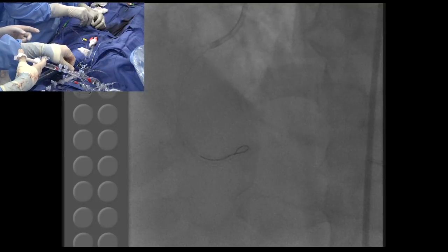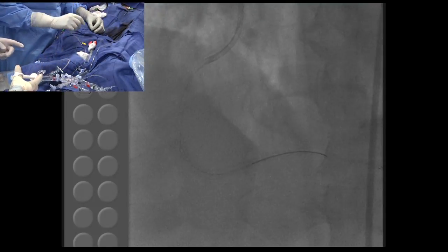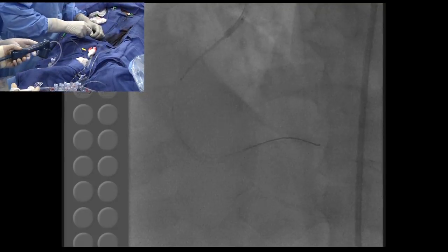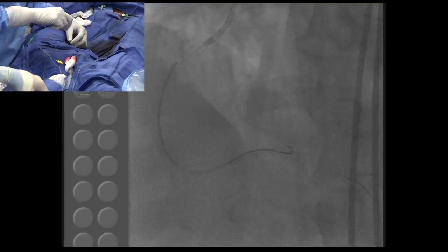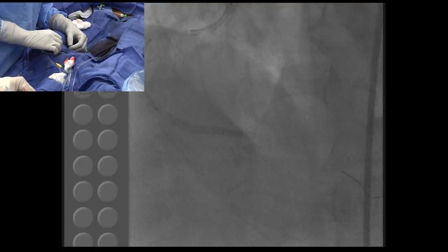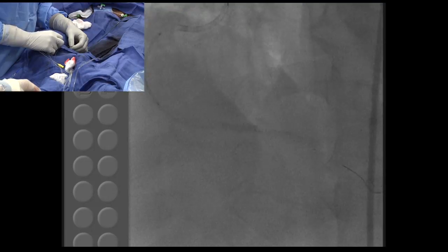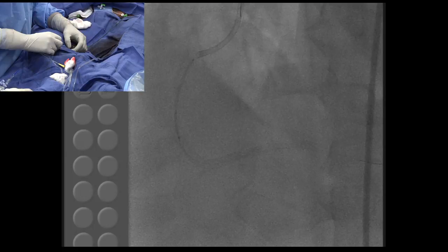Yes. Glad that you were able to add to your collection of contributions to interventional cardiology. I think this is extremely beneficial and hopefully cuts down some of the needless steps in a retrograde CTO. Take a big picture. No. Take a little picture.